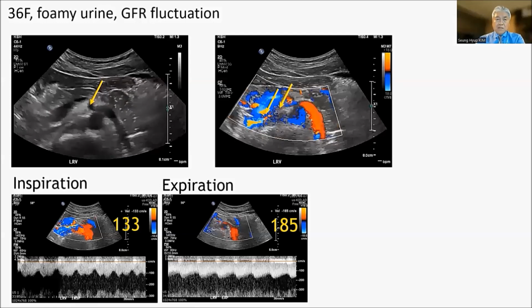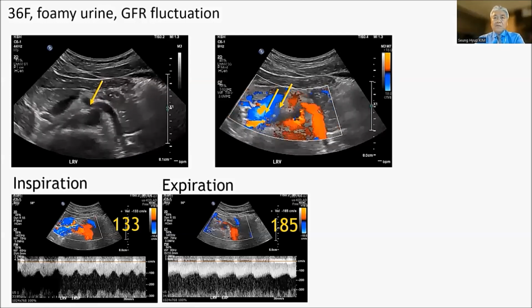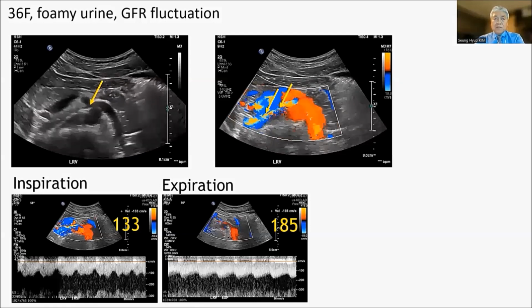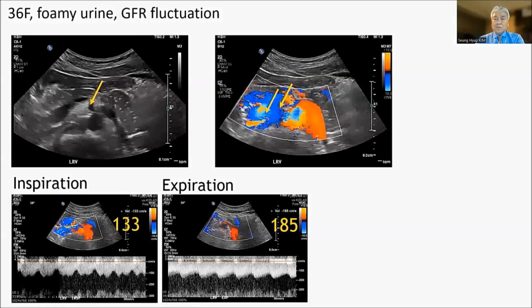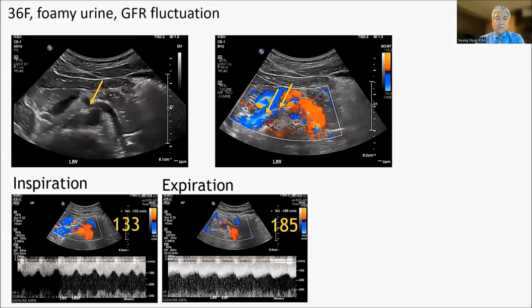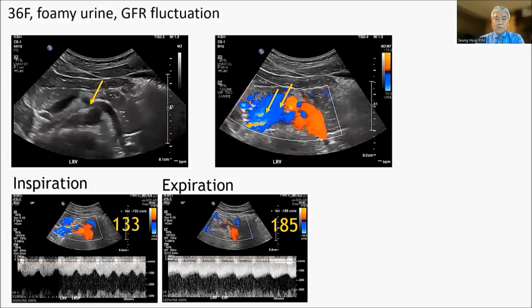Doppler spectra are clear and show continuously the same flow velocity because the patient stops respiration, but patients may have difficulty in holding respiration repeatedly. If patients are tired from holding respiration, it will be difficult to have the patient's cooperation.